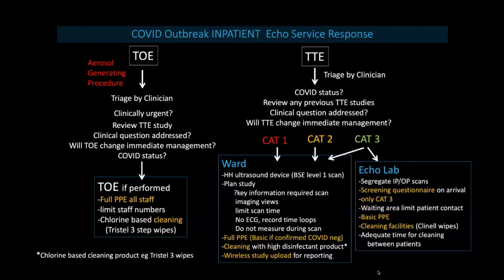So the first one is inpatient, and I'll just focus on TOE. We've talked about aerosol generating procedures being the highest risk in terms of infection risk. So remember that it's an oral intubation.